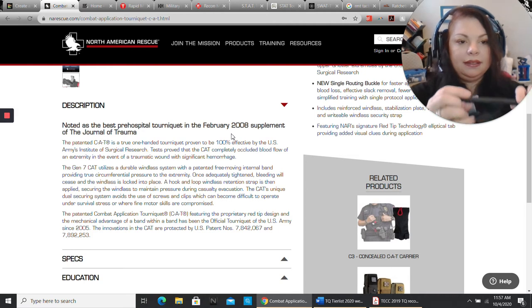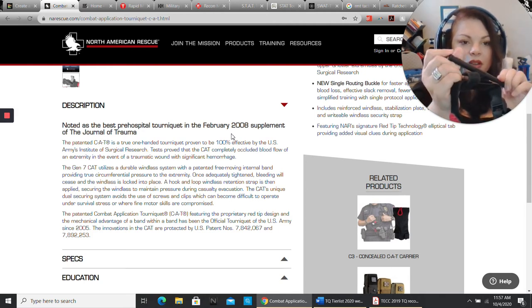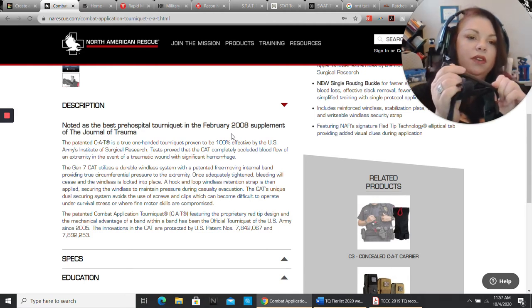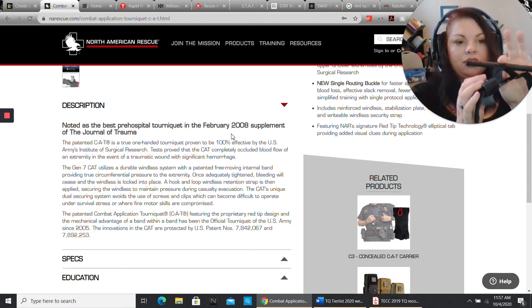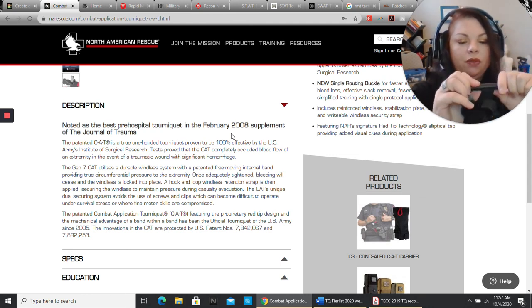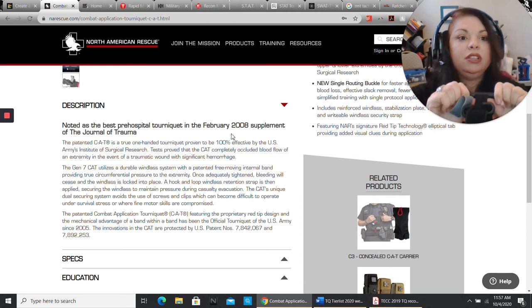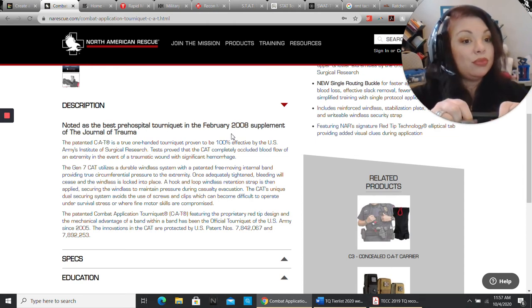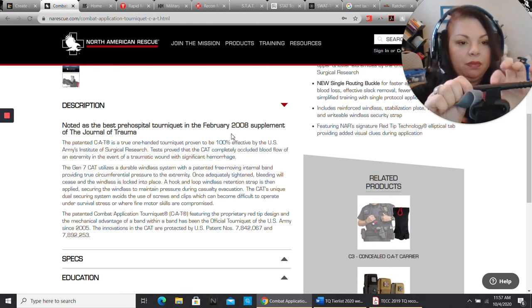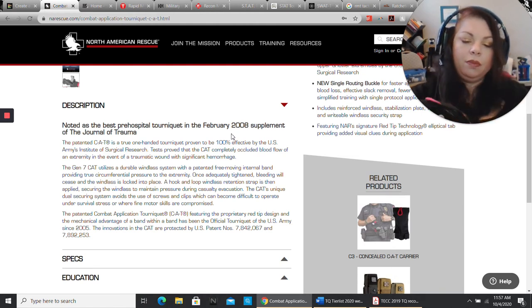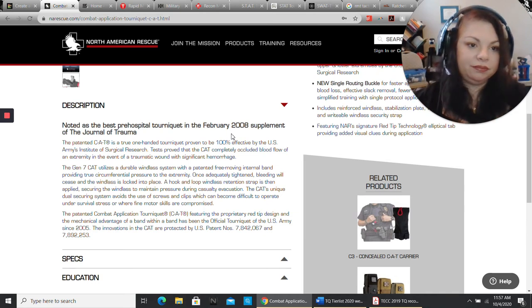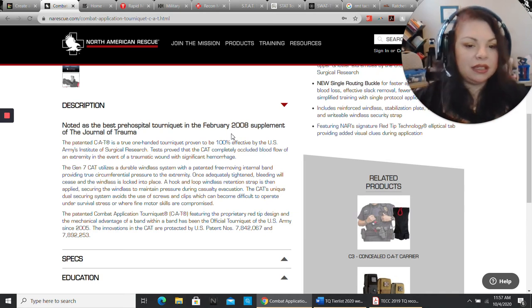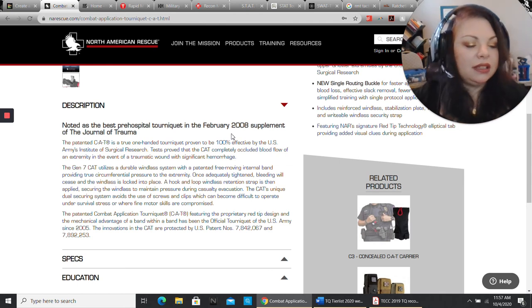I like the improvements they made to the windlass. This bit here, this ribbing is wonderful. This is so great for gripping. I like that they bulked up the centerpiece so that where you actually tighten it, I can't bend it, which is really good. Because there were some prior generations that I could bend. So that is good. This was one of the weak parts on it. But for ease of use, this thing is amazing. It's easy to thread, easy to tighten, easy to twist.